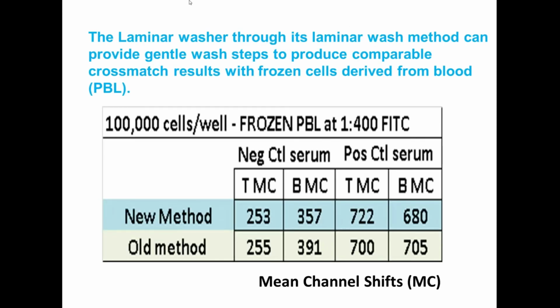And once again, the frozen cells appear the same when bound to both the negative and positive control serum. So in this slide here, I'd like to show you the crossmatch results, that they were just as expected for frozen cells. Negative crossmatch for the negative control serum and positive crossmatch for the positive control serum.